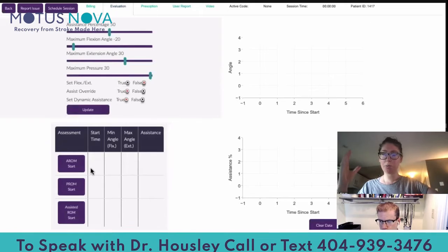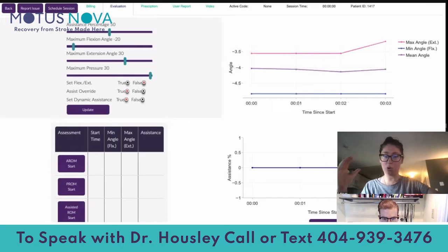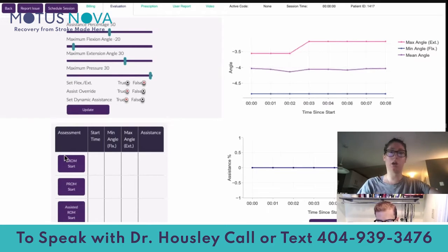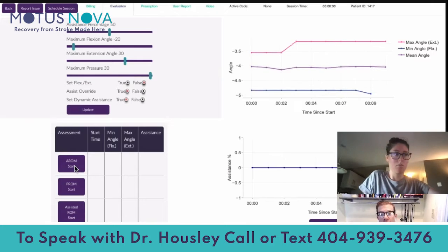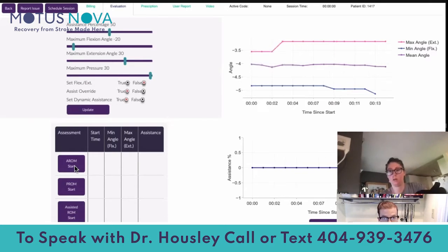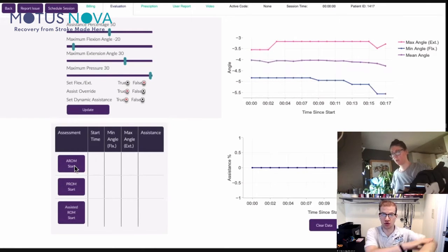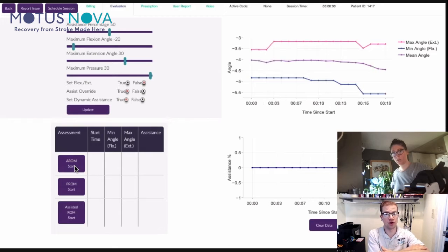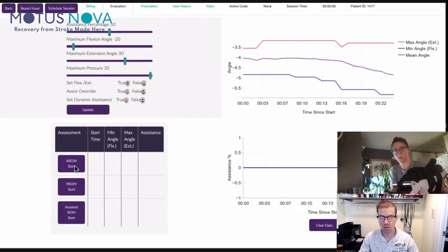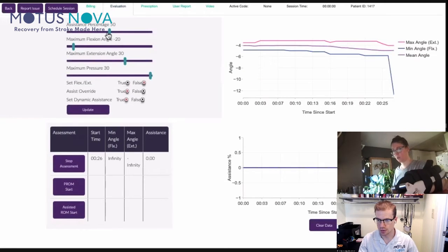Should I be, sometimes depending on the tone, I hold my forearm down with my right hand? That's fine. That's okay. Again, ultimately, we want to remove as many assistance mechanisms as possible. But for the time being, especially if you're very effortful and it's coming across the midline for you, if you need to brace it a little bit with that right arm, that's okay. That can be helpful. So let me just make sure we're getting data here.